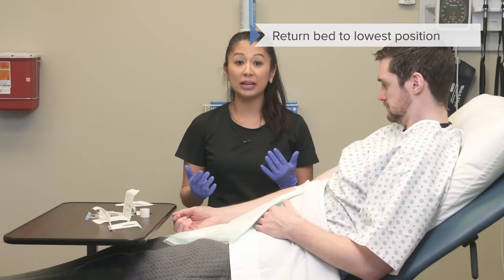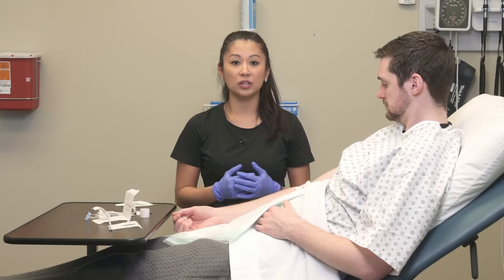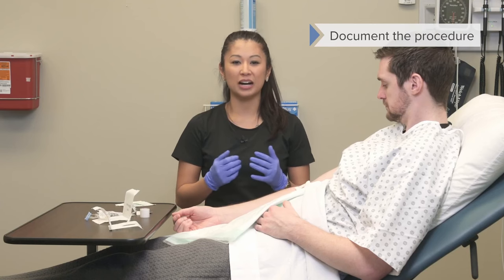Before you leave, don't forget to return the patient's bed to the lowest position. Make sure you discard all your supplies, remove your gloves, perform your hand hygiene, and document the procedure.